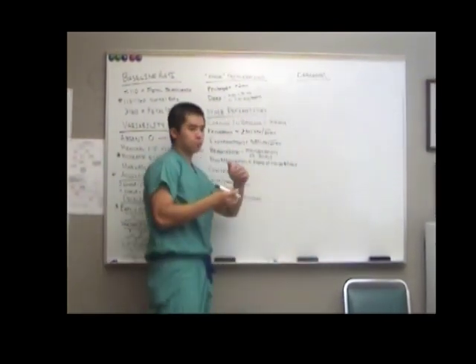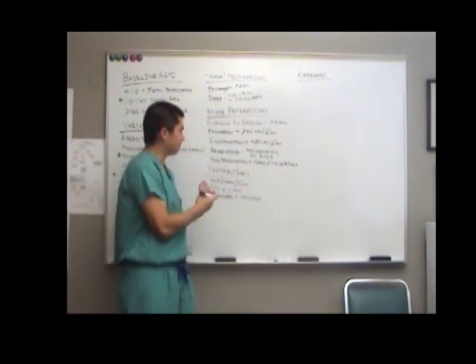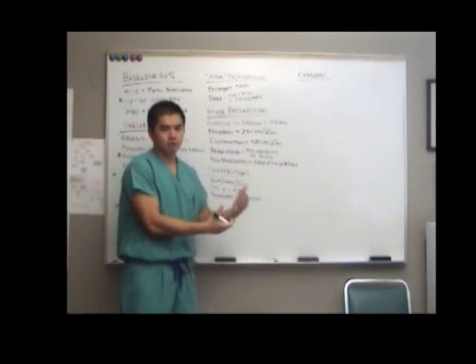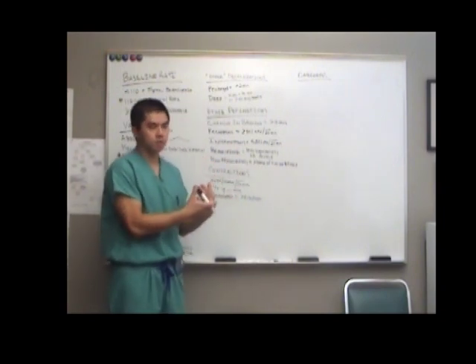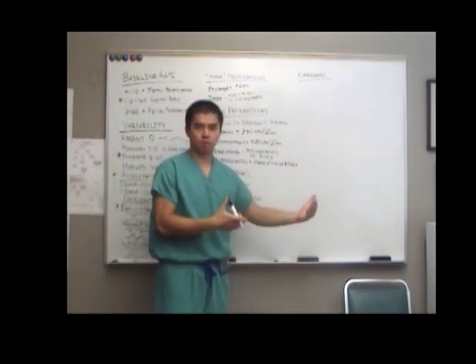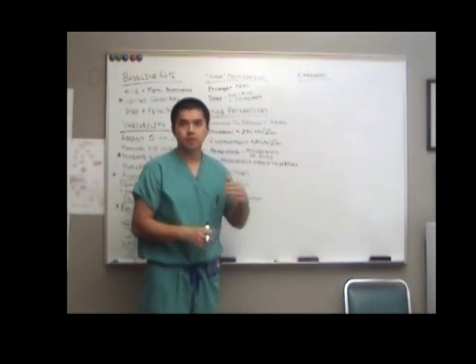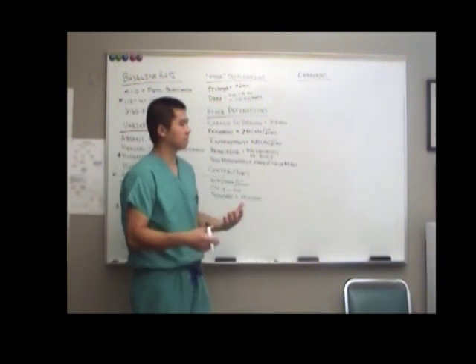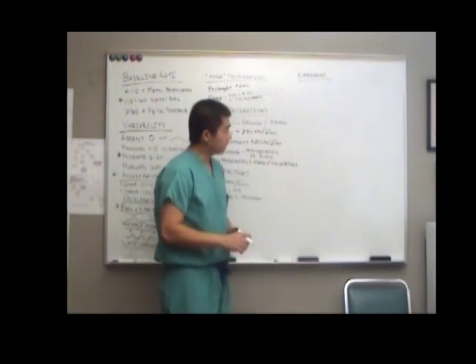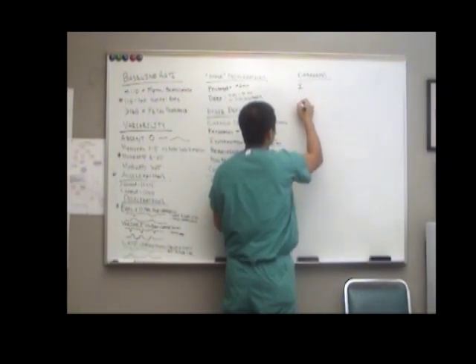Okay. Again, in med school, you may have focused a lot on the categories because it was on your test, but obviously I haven't focused on it very much because it's more important in how you describe the fetal heart tracing and whether or not you know the definitions, more so than whether or not you know what category a fetal heart tracing is. So when you're first starting out describing fetal heart tracings, don't just jump to the category. Because again, I said there's thousands of different category 1s, category 2s. And so with categories, we said there's 3 types of categories. 1, 2, and 3. Okay.